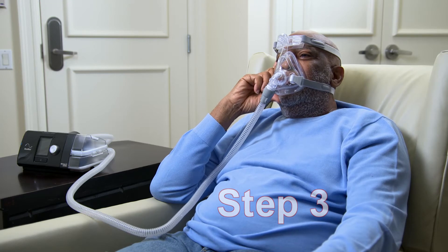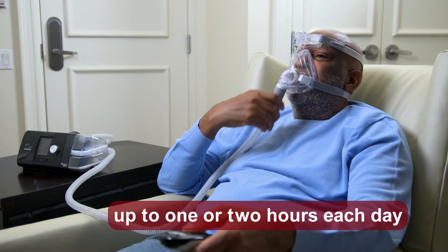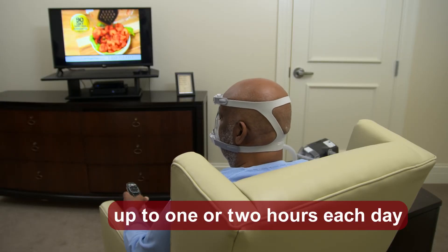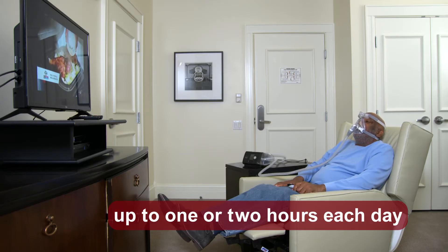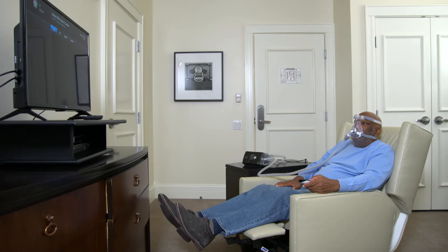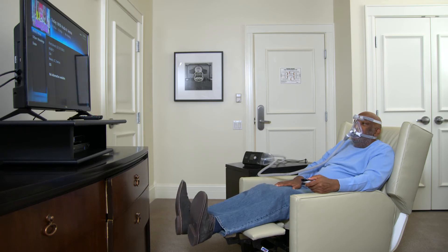Step 3 builds upon Step 2. Continue to wear your mask attached to the PAP device with the airflow turned on, but extend the time to an hour or two each day. Remember to do something relaxing or enjoyable, like watching TV. You might also try lying down or reclining. If you feel any anxiety or frustration creeping in, you can also use additional relaxation strategies, such as listening to calming sounds or music, guided meditation, muscle relaxation, or soothing imagery. Practice daily for a week, or until you feel very comfortable with this step.